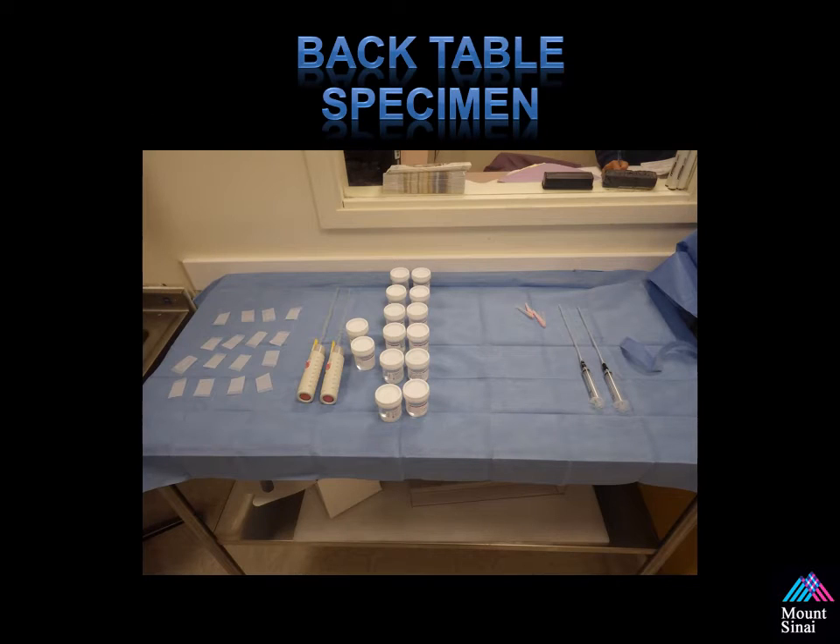The back table setup is pretty much standard. We have all our cups, needles, and lidocaine needles set up ahead of time to make it easy for our transition between steps during the procedure.